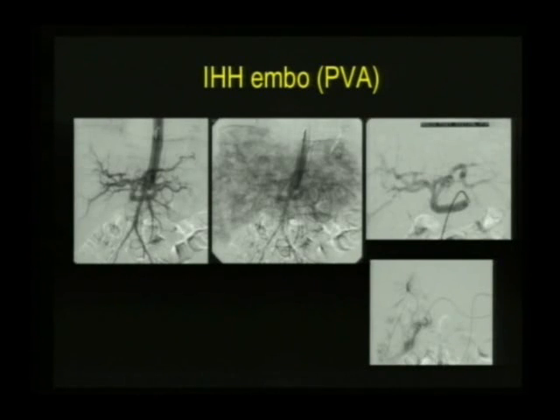You don't really need to be super selective to do that in a way, unless you actually are concerned about the portal vein supply to the liver, because if you actually have significant portovenous shunting and you do an arterial embolization, then the liver will not actually derive supply, its parenchyma will not supply from the portal vein if there's lots of portal vein to hepatic vein shunts. So you might, and you'll render the liver ischemic.